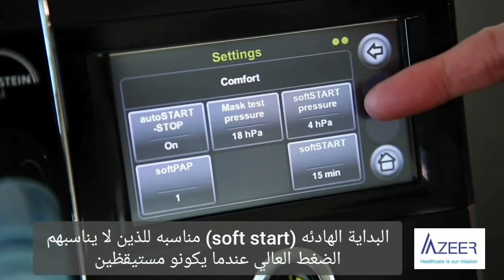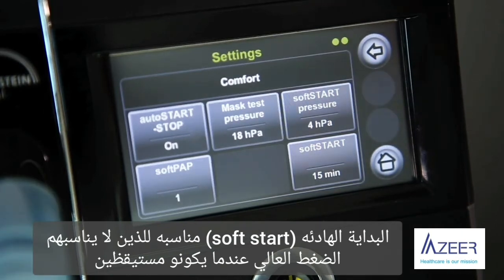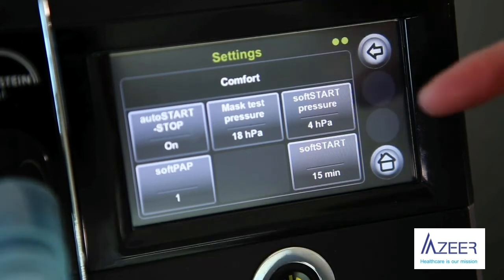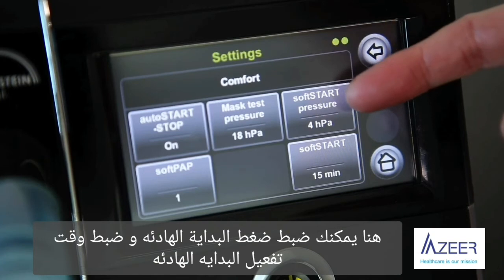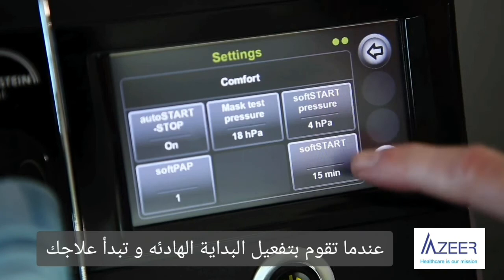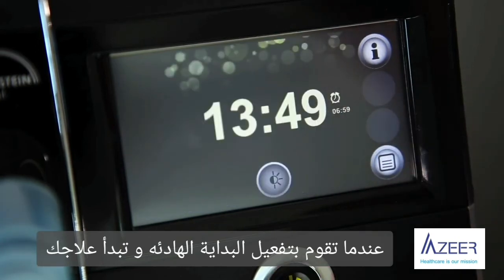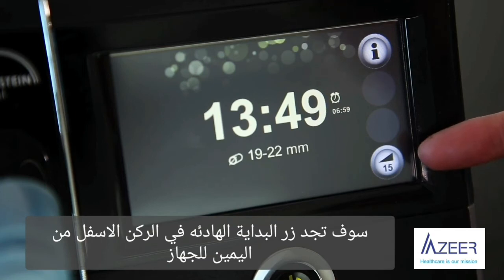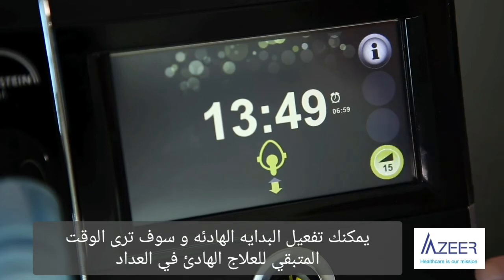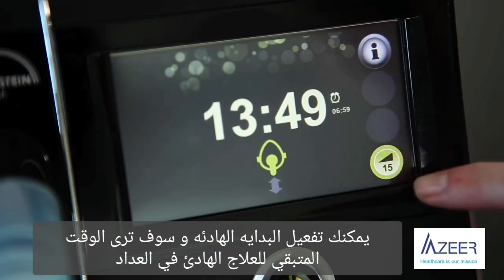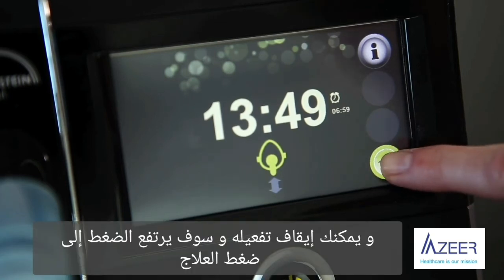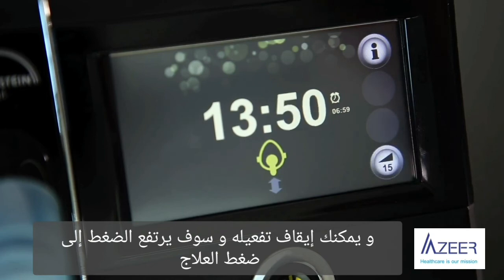The soft start function is suitable for patients who find high pressure unpleasant while they are awake and therefore cannot fall asleep. Here you can set the soft start pressure and the soft start time. When you activate the soft start and begin your therapy, you will find the soft start button at the lower right side of your display. You can activate the soft start and see the remaining time in the counter, or deactivate it so the pressure rises to the therapy pressure.